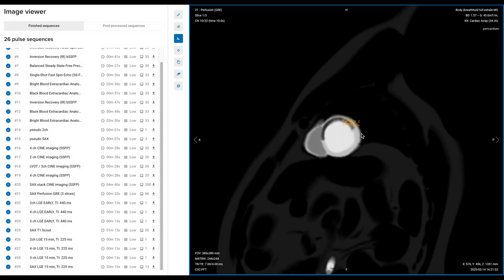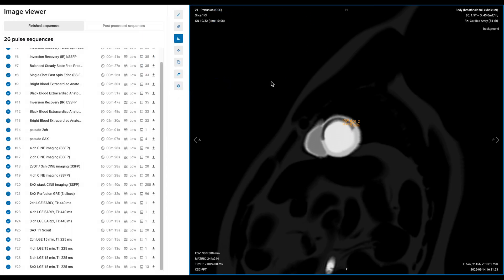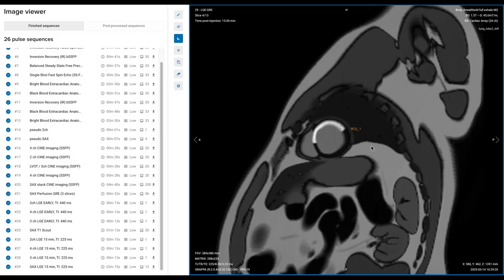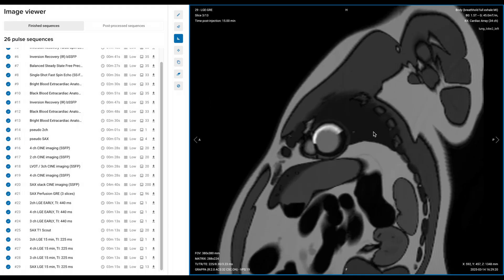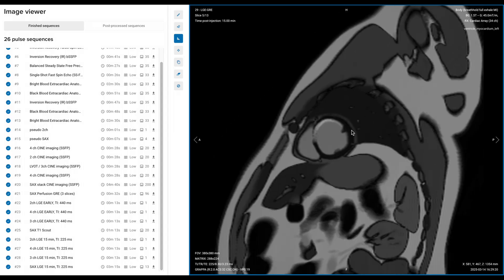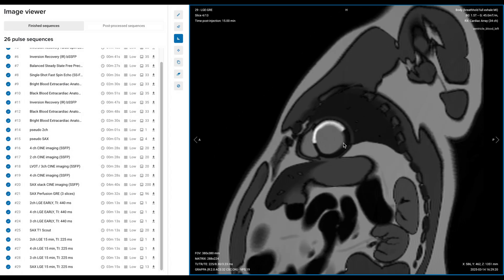There's still part of the myocardium that's viable or recoverable. While this other part over here is more likely a transmural scar. Then we have our late gadolinium enhancement, which lets us see our scar properly. As you can see, it's partly transmural and partly subendocardial. So the whole ventricle will be studied and divided into 16 sections plus one for the apical cap, according to the AHA standard model. The doctors will determine how much myocardium we can actually save and how much is lost to scar, helping them decide if procedures like bypass surgery or stents are worthwhile. They'll also help the patient understand the risk for future heart attacks or worsening coronary artery disease.